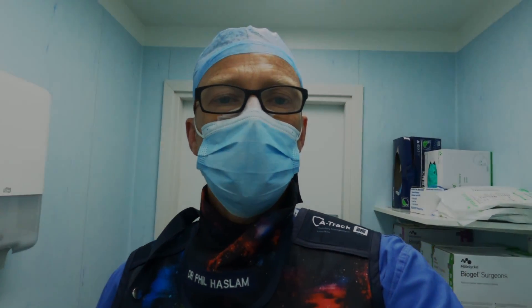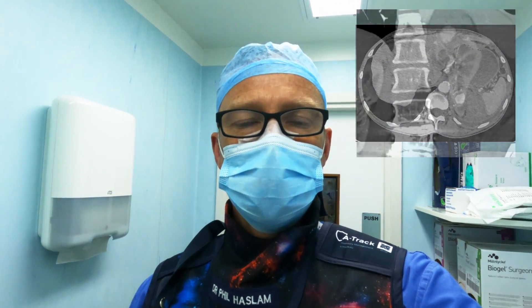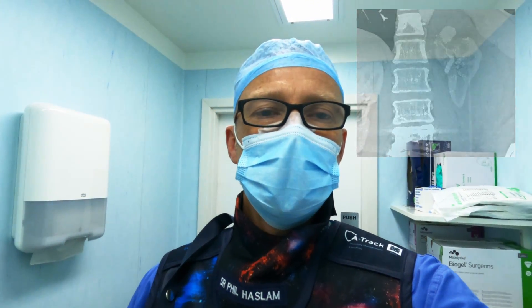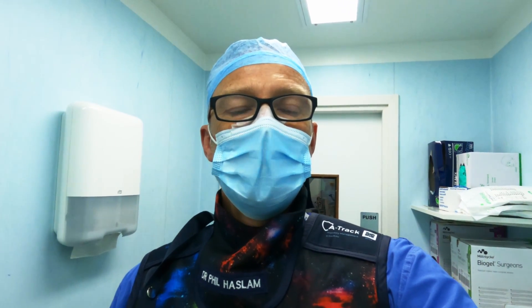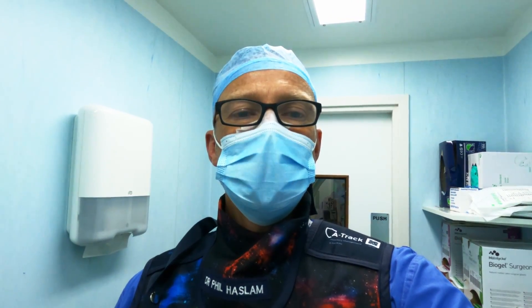I've got a patient here who had a partial nephrectomy about 10 days ago. She presented last night with haematuria and loin pain, and as you can see on the CT, she's got a rather large pseudoaneurysm arising from the upper pole, which is the partial nephrectomy site. What I'm going to do is a right femoral puncture, selectively catheterise the left renal artery, perform angiography to localise the exact feeding point, and probably coil it — although I could use onyx or glue. We'll see how many feeding vessels there are, as sometimes you get more than one.